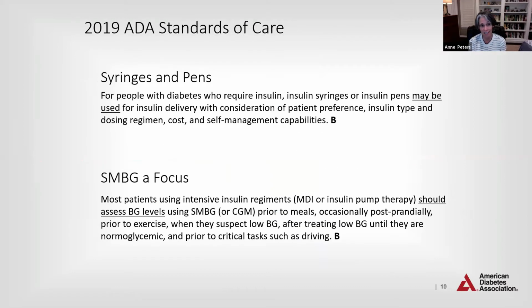So surprisingly, we didn't have a separate section in the standards of care about devices until the 2019 standards of care. It was just kind of mixed in with everything else. And remember that the standards of care are written the year before. So in 2018, the Professional Practice Committee who writes the standards was working on the standards of care that were going to be the first ever device guidelines. And there's always one champion person within the Professional Practice Committee who takes a section. And the device section has been section 7. And then that person uses a couple of other people from the Professional Practice Committee and can ask for outside help.